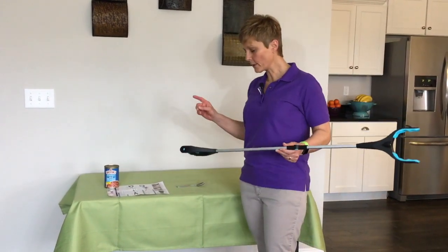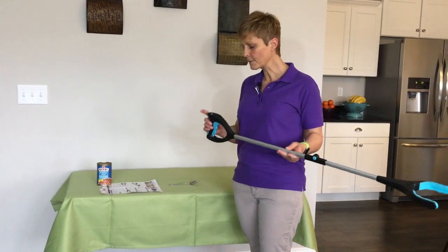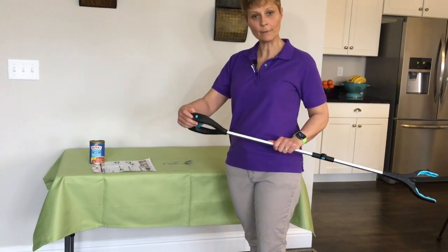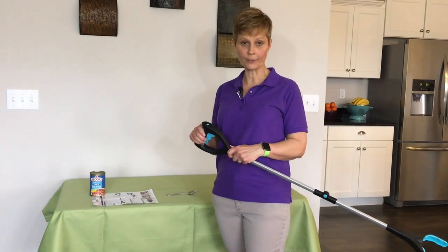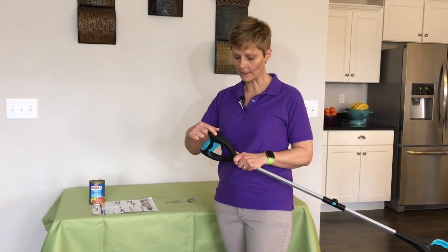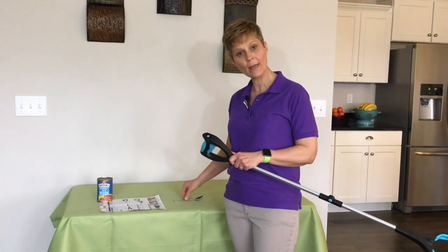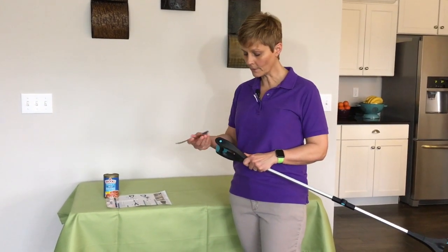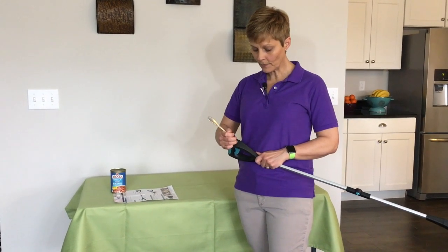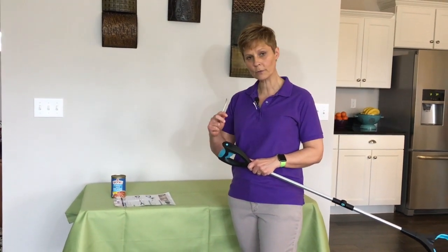Now I want to demonstrate the ratcheting part of this reacher. I do want to say this is the only feature that concerns me a little bit. You have to move this sliding button back and forth here on the top, and I want to tell you it's difficult to get back. The lip here to pull it back is a little short and I can't get a hold of it. What I ended up having to do is use a spoon — I put it on the little lip and used the force of my hands to pull it back. It was pretty easy to do it that way, but I could not do it with my fingers.